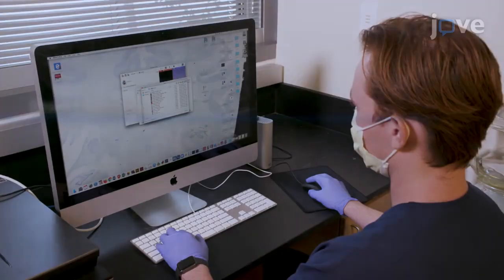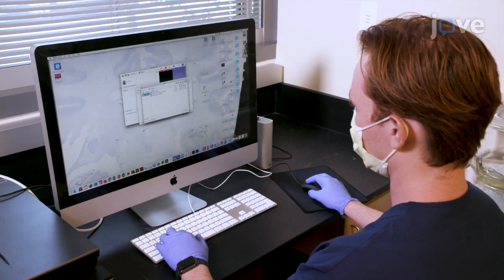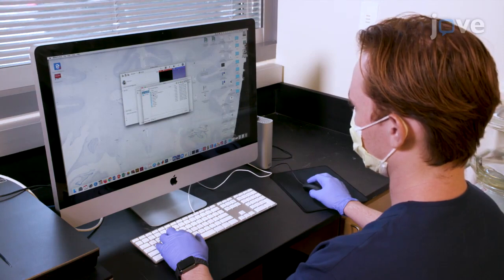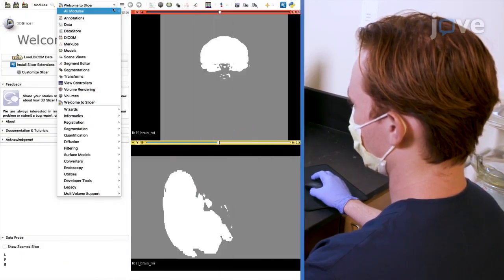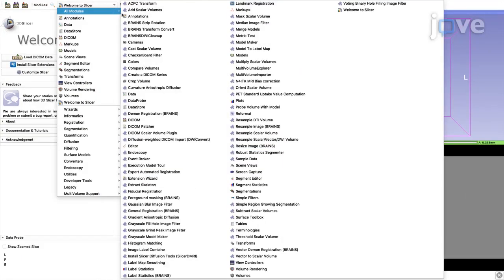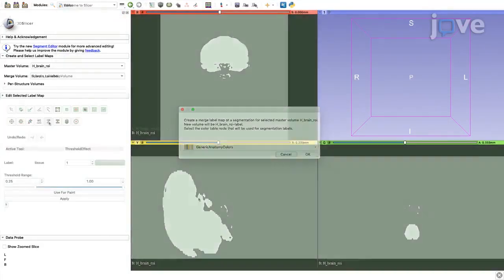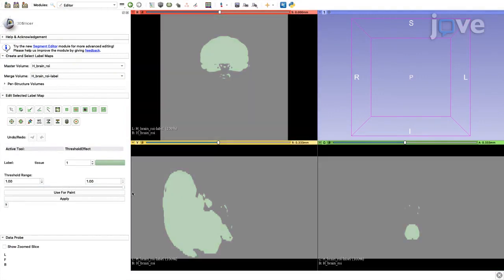To generate a brain model, open the extracted brain file in the appropriate medical image processing software. In the Editor Module menu, select Threshold Effect to adjust the threshold range sliders so the portion of the bitmap containing the brain is highlighted in all three slices.